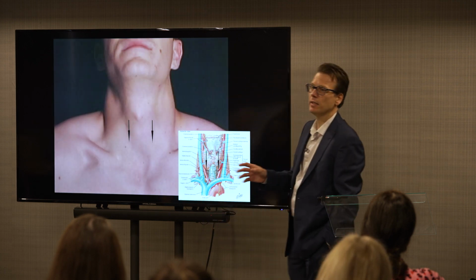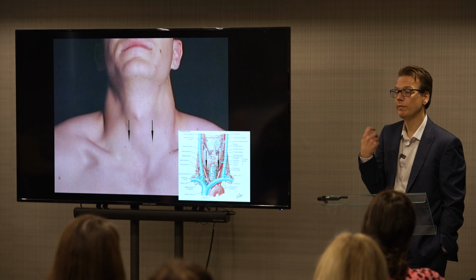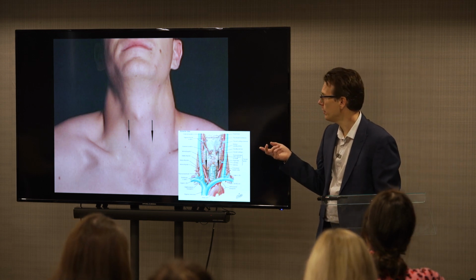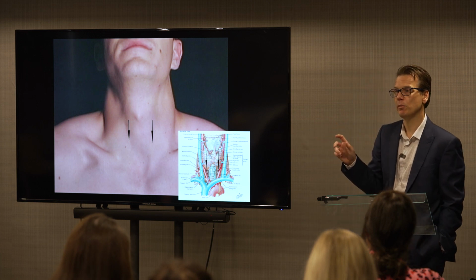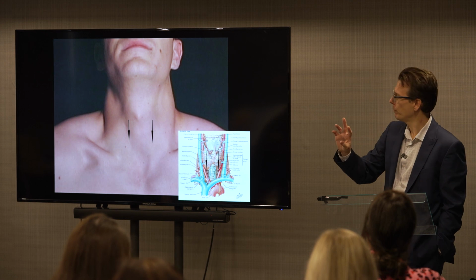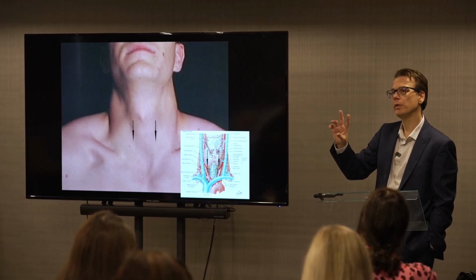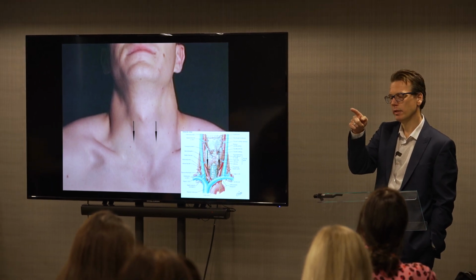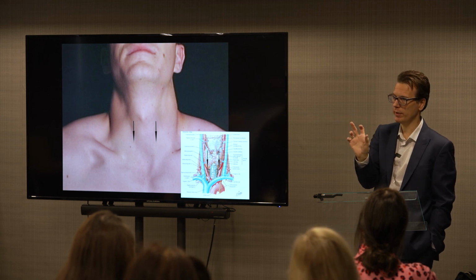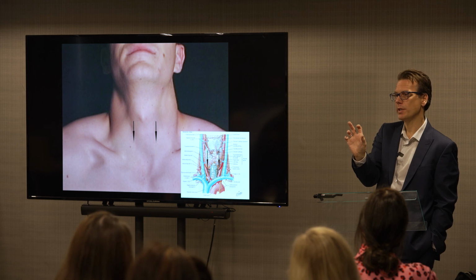Once I've done that, I want to look at the thyroid lobes individually. At this point, I also calibrate the color Doppler. On the machine, you can change the gain. The idea is that when you put the color on, the color remains within the wall of the common carotid, so you place the probe over the common carotid.